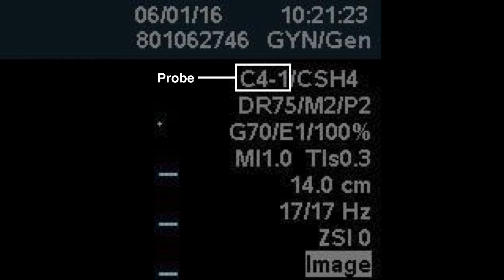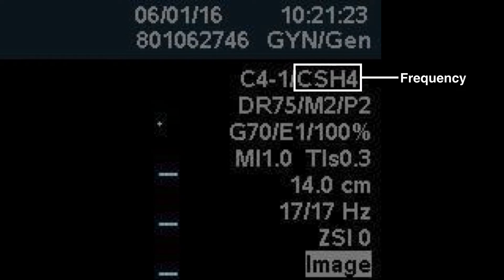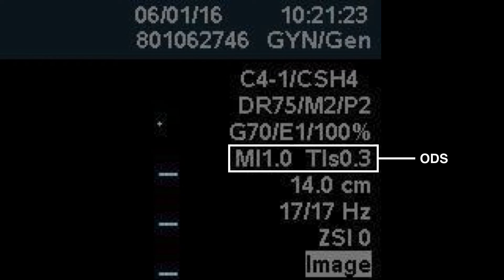You'll also see the probe that is active — in this case the C4-1, or curved array 4 to 1 megahertz — along with the frequency setting. Here you will have compound imaging on, harmonic imaging, and you're imaging at 4 megahertz, which is the highest frequency for that probe.